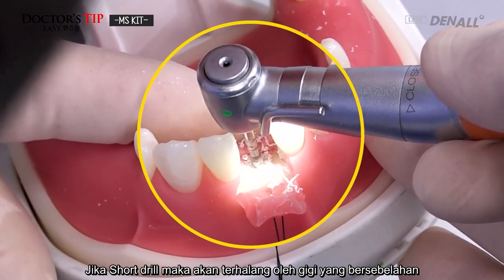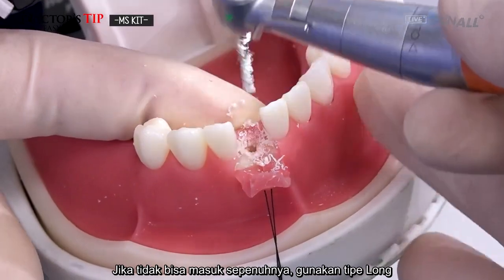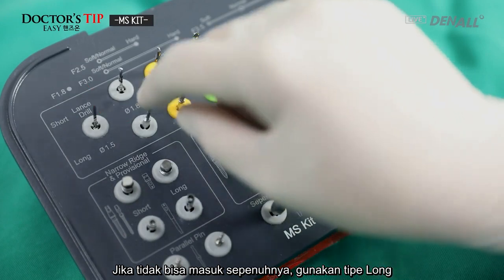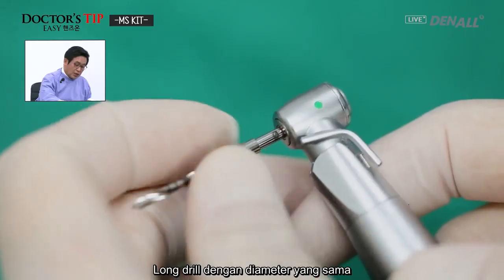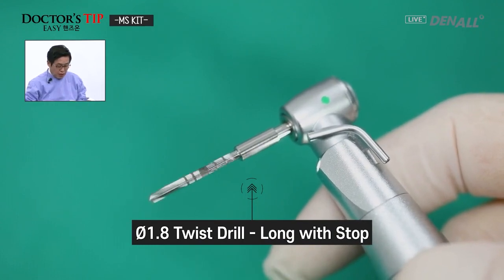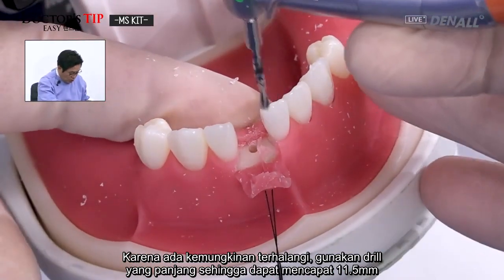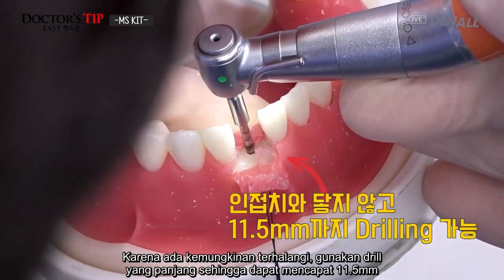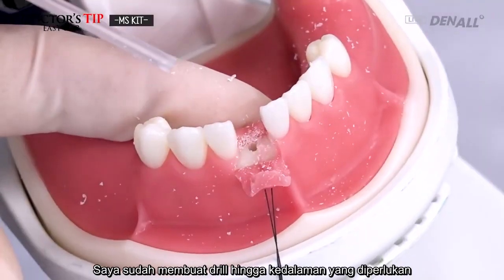If it's a short drill, then there could be interference from adjacent teeth. And if you therefore cannot go to the full length, then you change to the long type, the long shaft drill. Same diameter, use the longer version. So it's a long one with a stop. And again, because there could be interference in the mandibular anterior, you use the longer version of the drill, sufficient to go up to 11.5 millimeters. So I have it drilled up to that level.